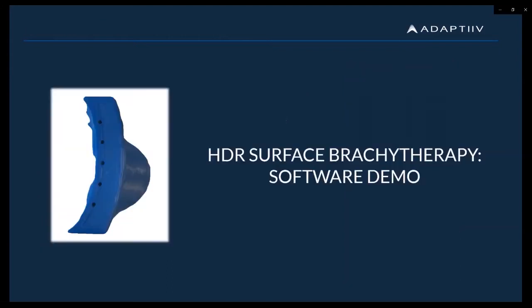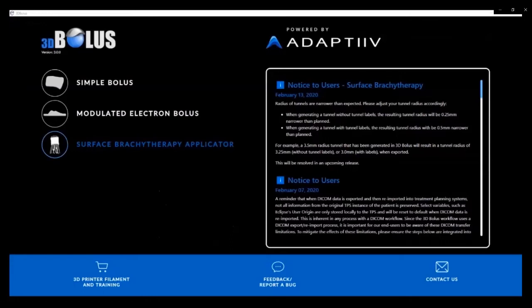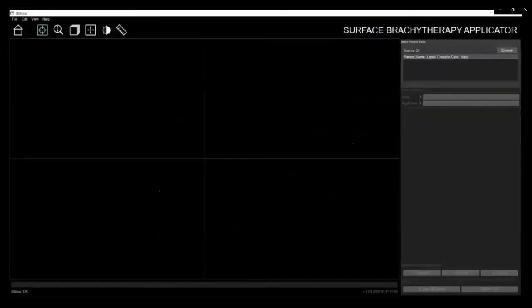Now, let's take a look at our software. From the home screen, select the Surface Brachy Therapy Applicator Module. Once open, you can import patient information from your TPS into our software.